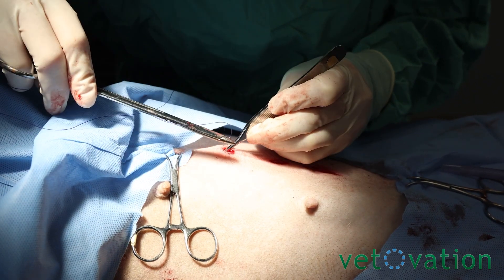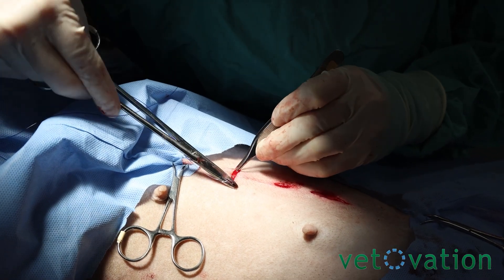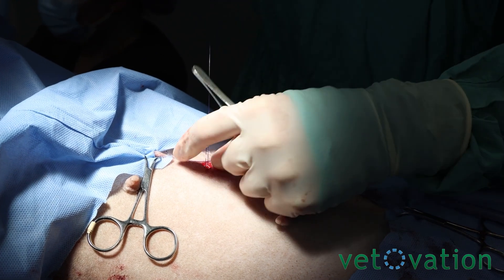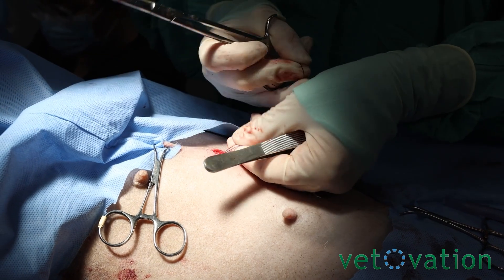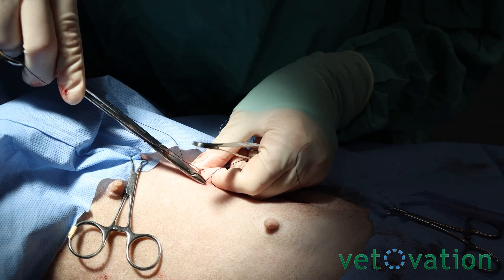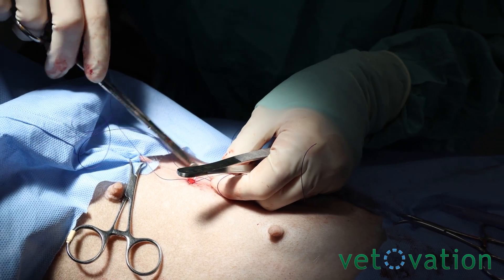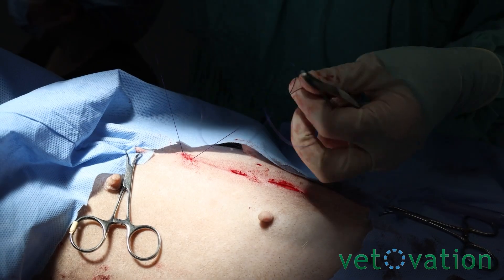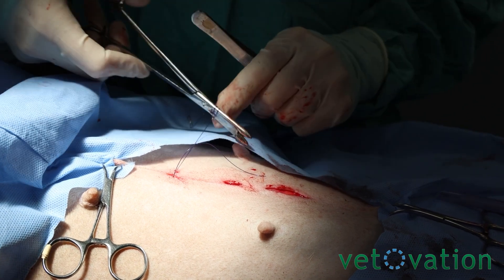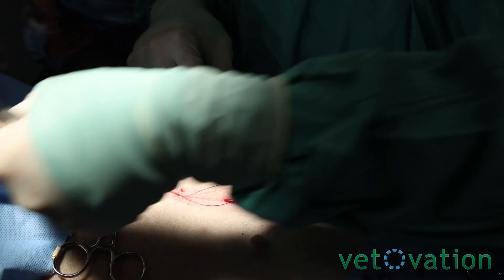I'm getting the linea as best as I can — you can feel it, you can visualize it on your first bite, and then I use my suture to kind of pull up on it too so I can get my second bite through the linea, and I just kind of walk that needle up. Now we have a deep cruciate, and then I pull it parallel to my incision.